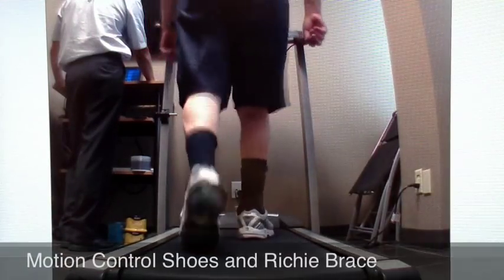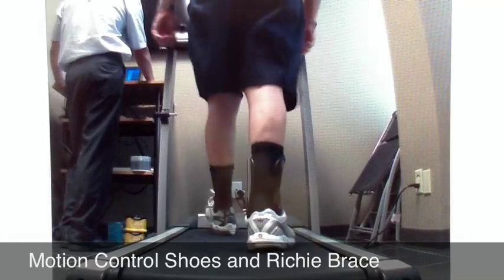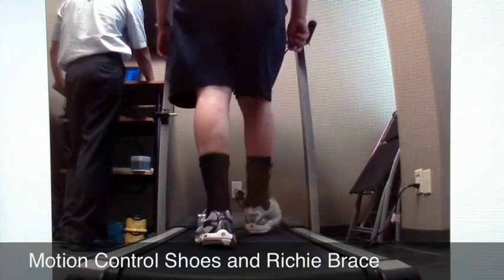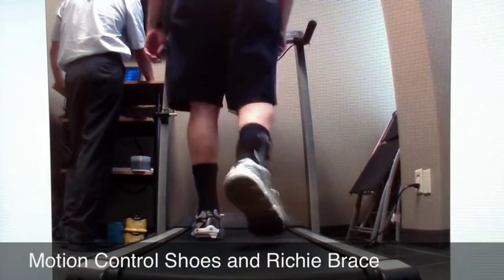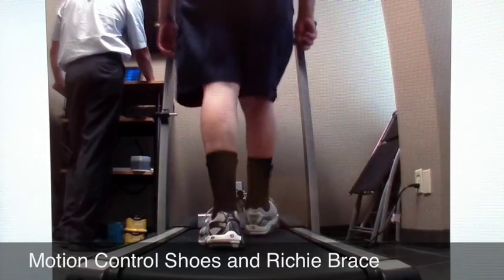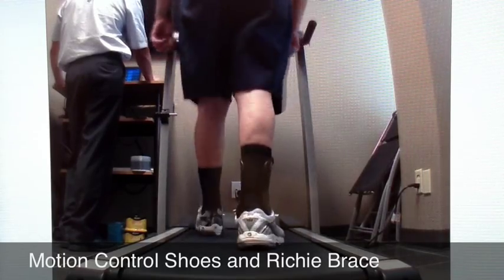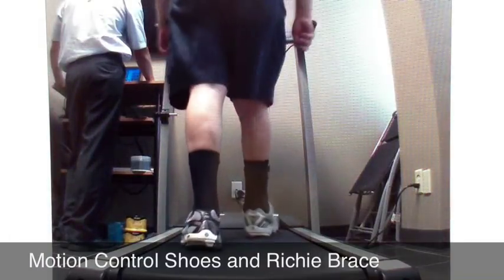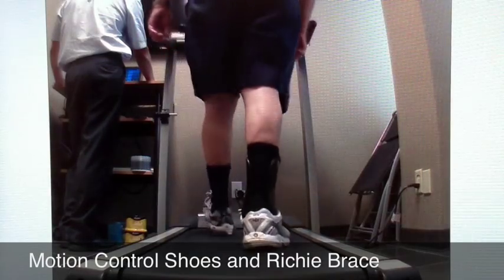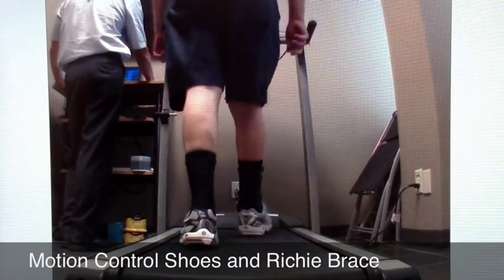An even greater improvement is seen with the use of a Richie Brace. A Richie Brace is a hinged ankle foot orthoses and custom foot orthotic combination. Note his improved heel strike and decreased forefoot abduction when compared to walking barefoot and in shoes with a custom foot orthotic.